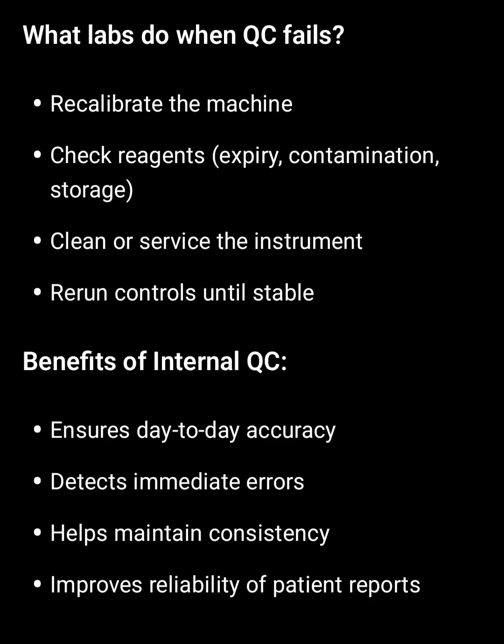What do labs do when QC fails? Recalibrate the machine, check reagents, expiry, contamination and storage dates, clean or service the instrument, and rerun the control until stable. Benefits of internal QC: ensures day-to-day accuracy, detects immediate errors, helps maintain consistency, improves reliability of patient reports.